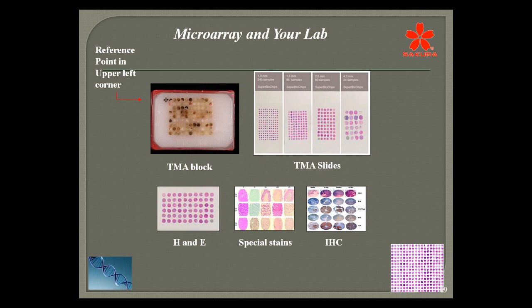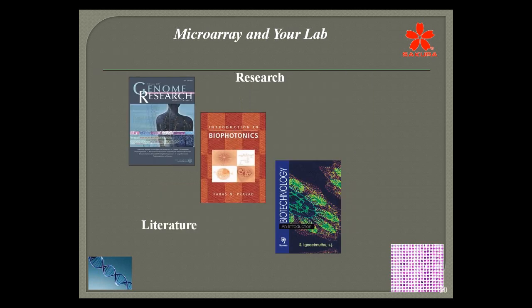IHC would be very similar. If you have tissues that have Reed-Sternberg cells in them, you wouldn't want to exhaust that with a lot of other tissues for just general immunohistochemistry. You want to save those for your CD15 or CD30 specifically, and just use one piece. So an array does have some disadvantages. They're very few, and that's one of them. But the advantages of using them, I think, outweigh the disadvantages.